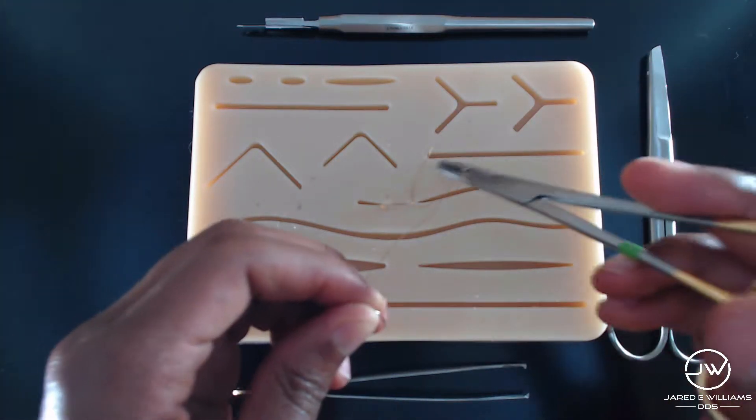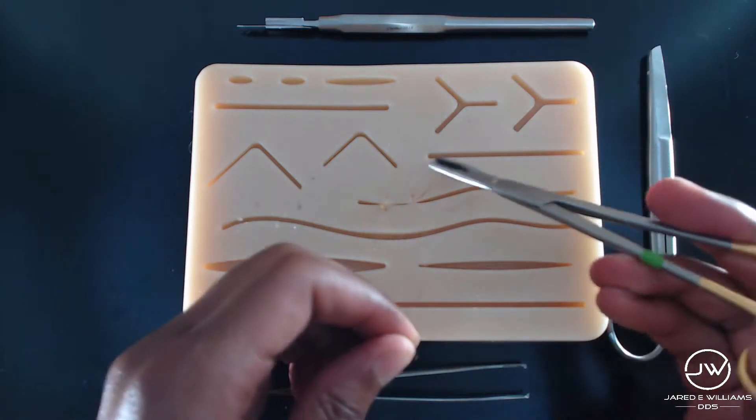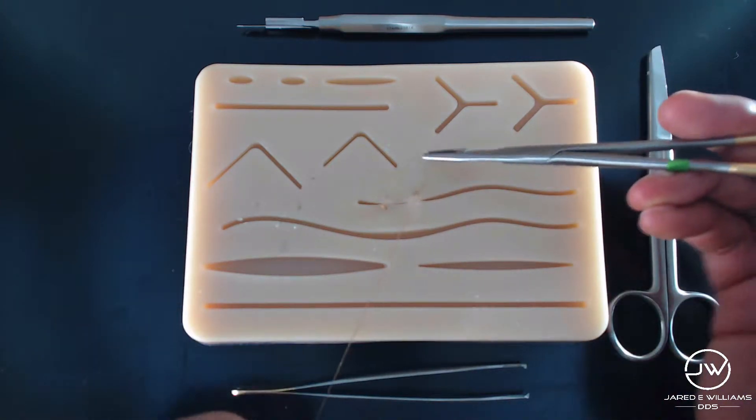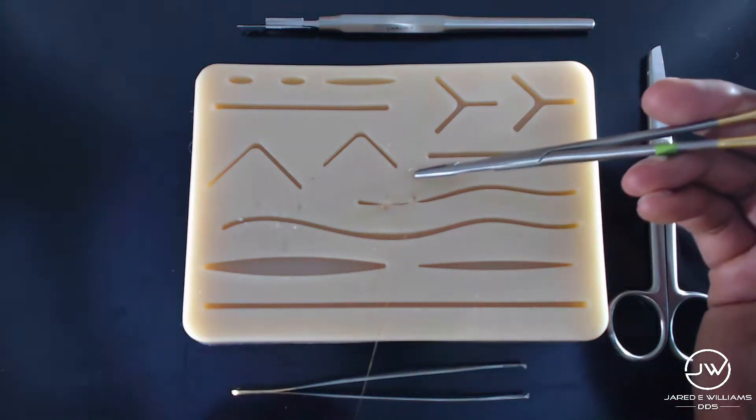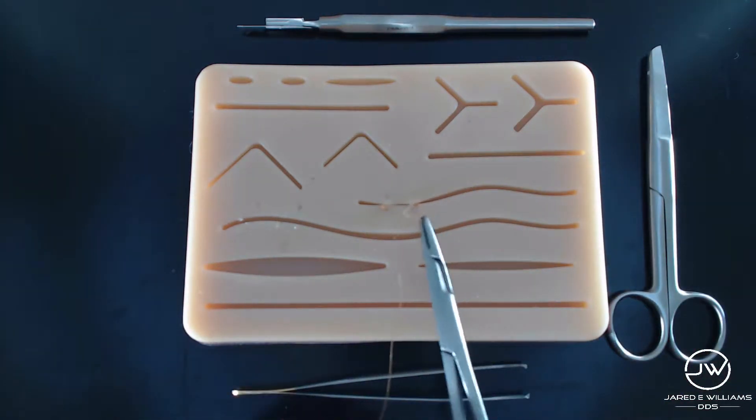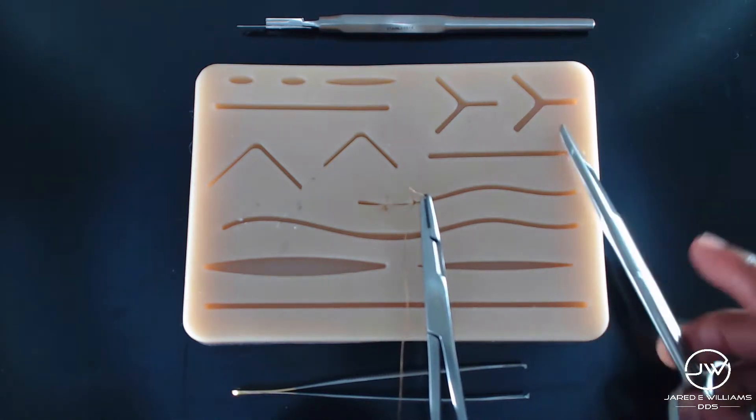And I'm going to go on top, on bottom. And yes, that's a word. On bottom is a word. On top, and then on top. So, once again, you don't want to make the suture too tight because if you do, then it can unravel.